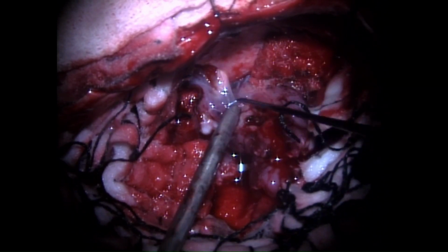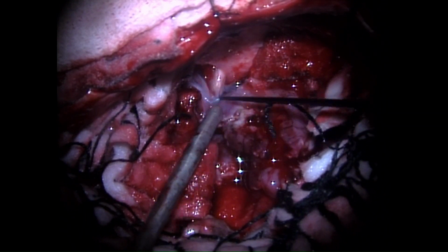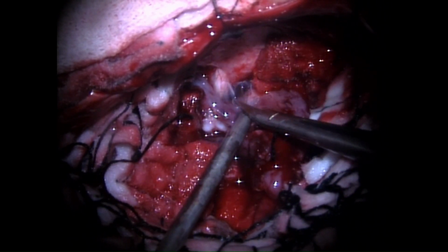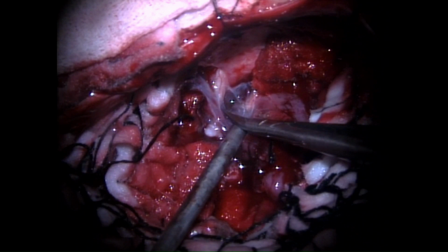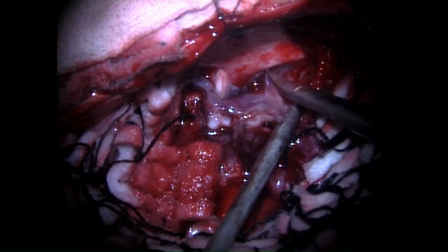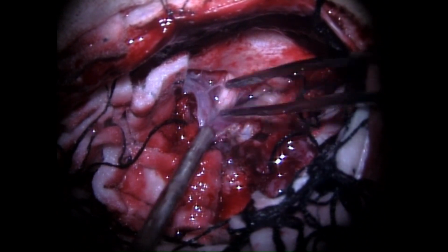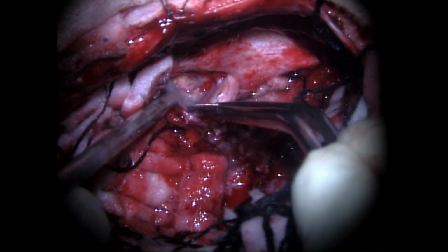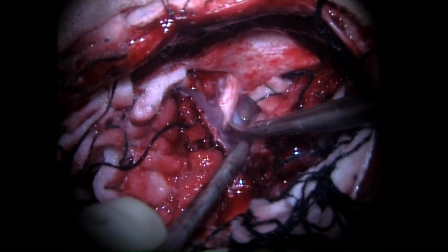Again, coming to the area of the optic chiasm, this time to decrease the tumor which is attached to the optic chiasm and the optic nerve, as well as the anterior wall of the third ventricle in the area of lamina terminalis and the bilateral thalami, exploiting the arachnoid to help us with the dissection of tumor off these critical neurovascular structures. See the optic nerve on the contralateral side as well.